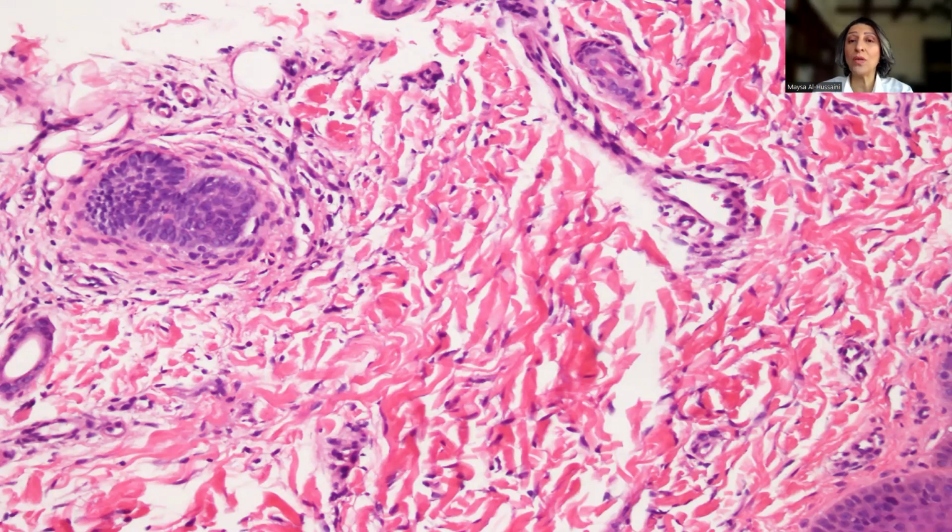Number two, with skin biopsies, especially when the skin biopsy is not bisected, you really have to examine several serial and deeper levels, until sometimes you consume the specimen. It depends, because quite often the focal, inobvious, indiscernible finding can only be identified after examining several deeper levels, especially if we're looking at something that is very subtle.